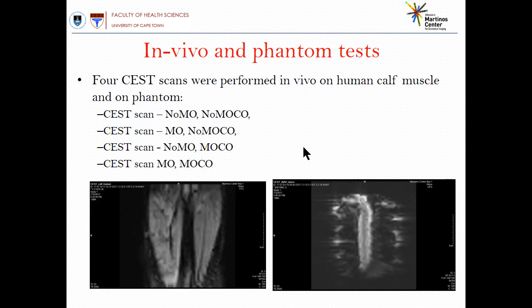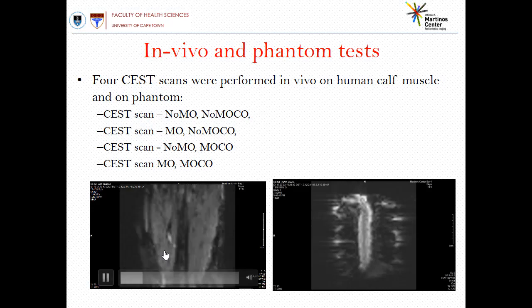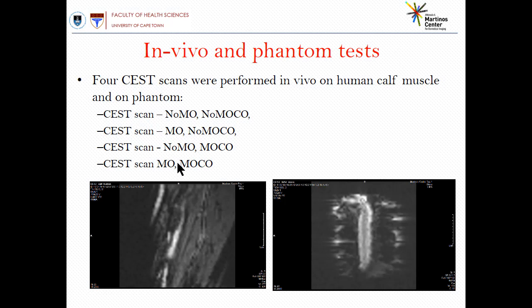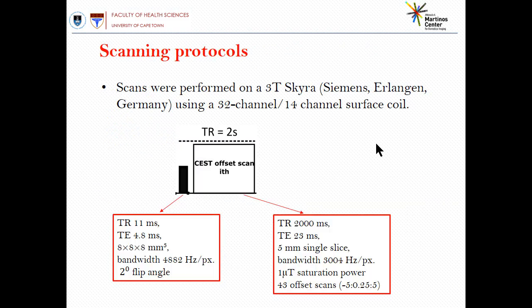So to validate this technique, we performed 4 kinds of scans: CEST scan with no motion and no motion correction, CEST scan with motion and no motion correction, CEST scan with no motion and motion correction, and CEST scan with motion and motion correction.